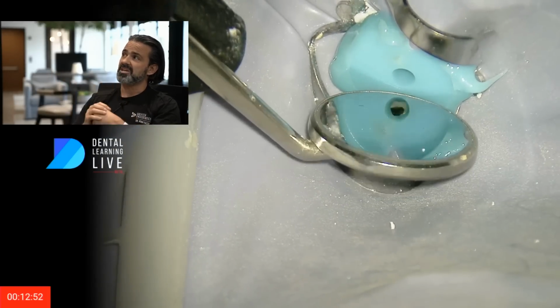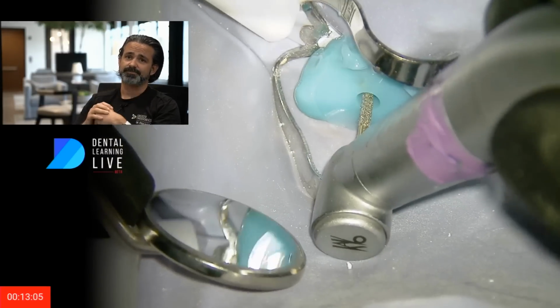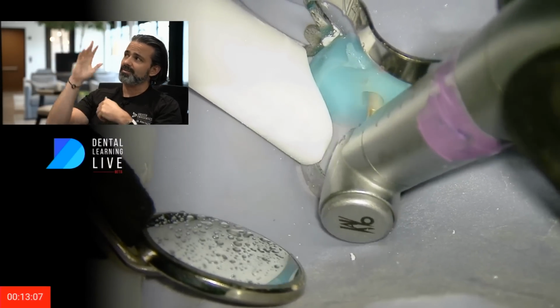And then you can't cure it too much, so once you pop the matrix off, you can just take it out, recure it, make sure it's set.